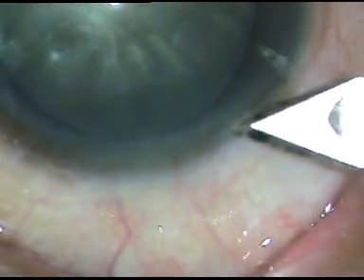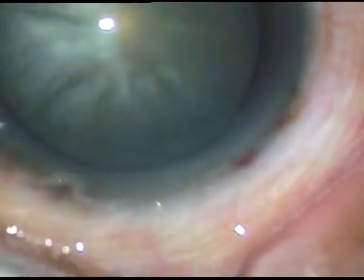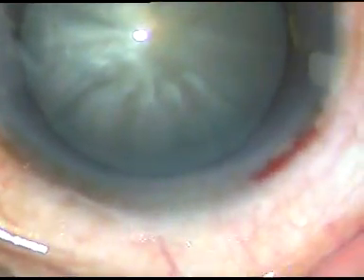Dear colleagues, this is phacoemulsification of an intumescent cataract. We can see fluid-filled elongated radial pockets beneath the anterior capsule which indicates intumescence.